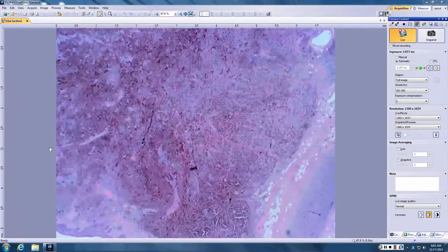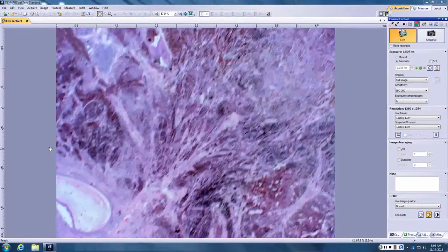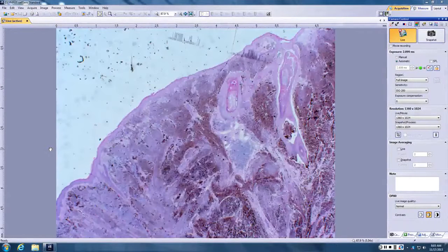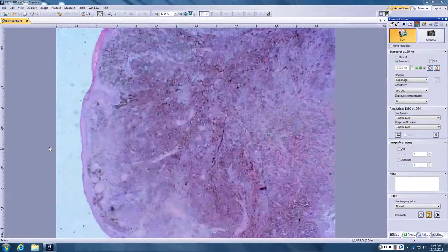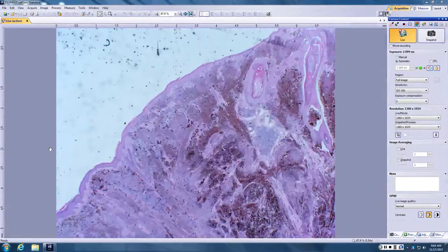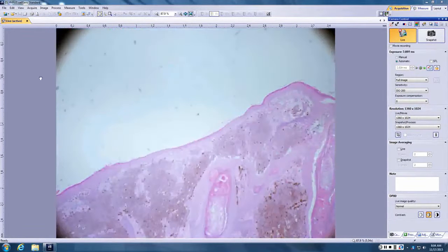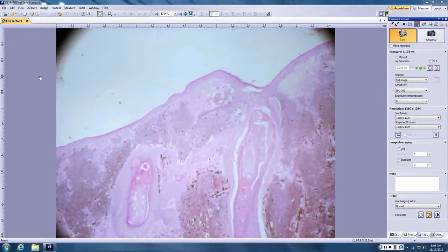Oh, it's a very big melanocytic nodular. Okay, so from scan, are you thinking this is a good thing for the patient? Or a bad thing for the patient? I think it's too big. I agree. I agree 100%.